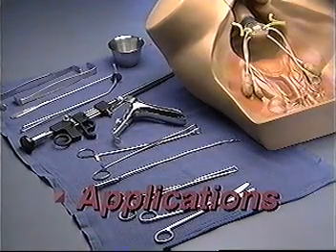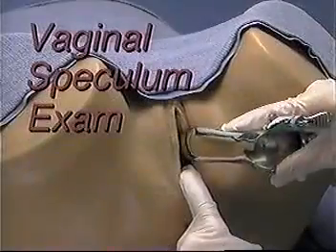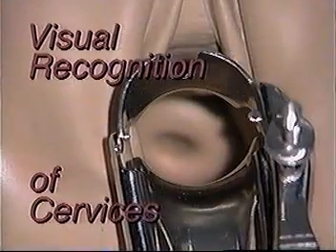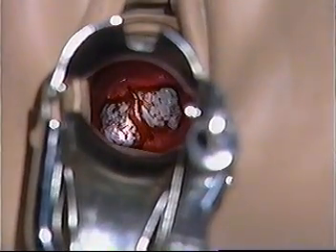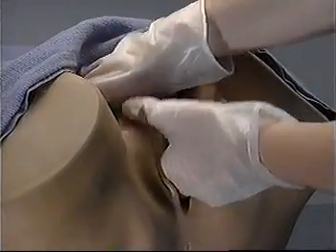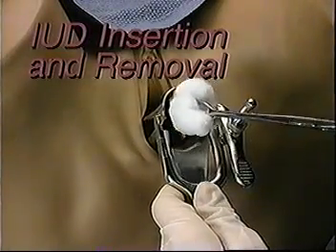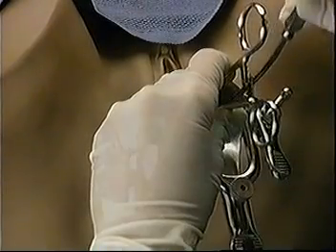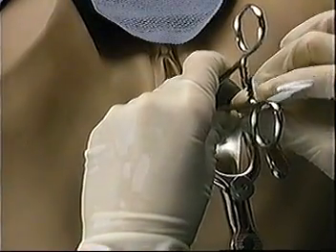Applications. ZOE is a versatile training tool ideal for demonstrating and practicing the following procedures. Vaginal speculum exam using a bivalve speculum, allowing visual recognition of normal cervices as well as cervical abnormalities. Bimanual pelvic exam, including palpation of normal and pregnant uteri. IUD insertion and removal, including swabbing the cervix, applying the tenaculum, sounding the uterus, and actual insertion from inserting the applicator to cutting the strings.